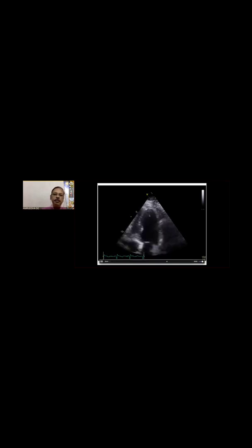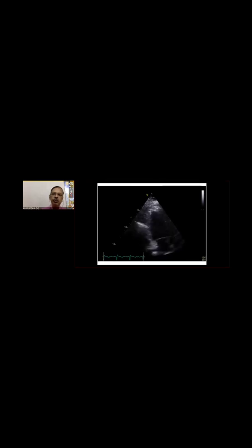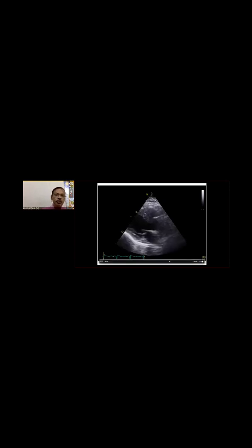I'll give an example of two ischemic heart disease cases where there is a doubtful segmental RWMA, but GLS will give you good gains by the bullseye phenomenon. A 50-year-old lady presented with chest pain suggestive of acute coronary syndrome. From this patient, you can hardly find any regional abnormality. In this view also, RWMA is not clearly seen, and even in the two chamber, there is some suspicion that the inferior wall may be hypokinetic, but not clear. But if you go to the parasternal long axis view, you can see the posterior wall is definitely hypokinetic.